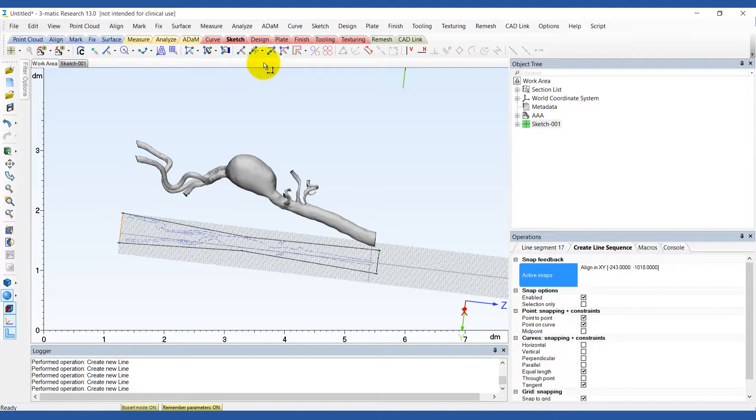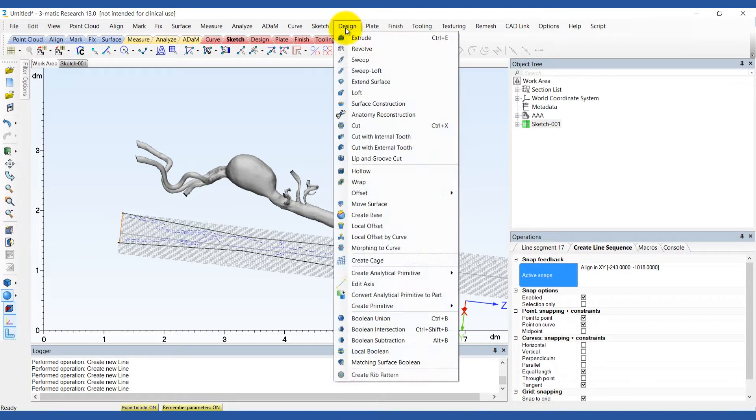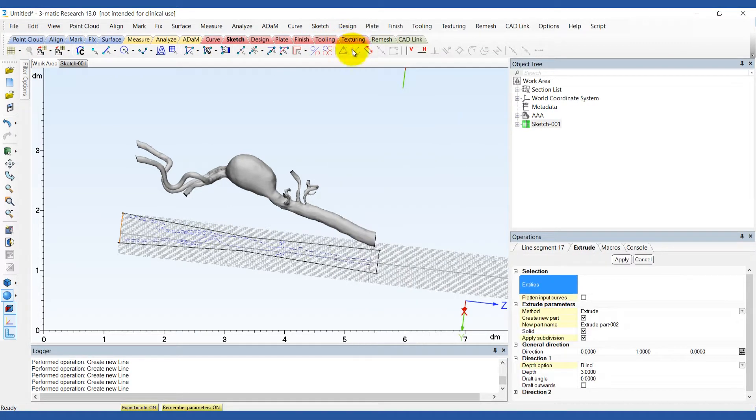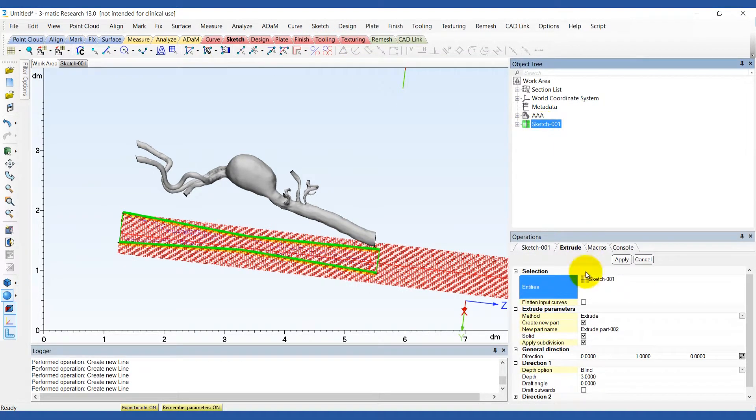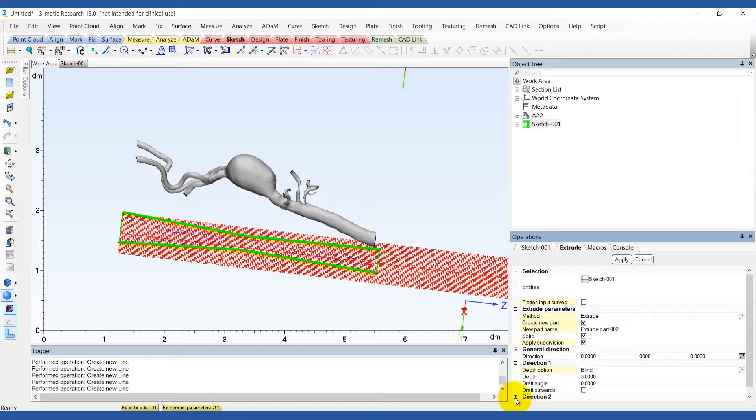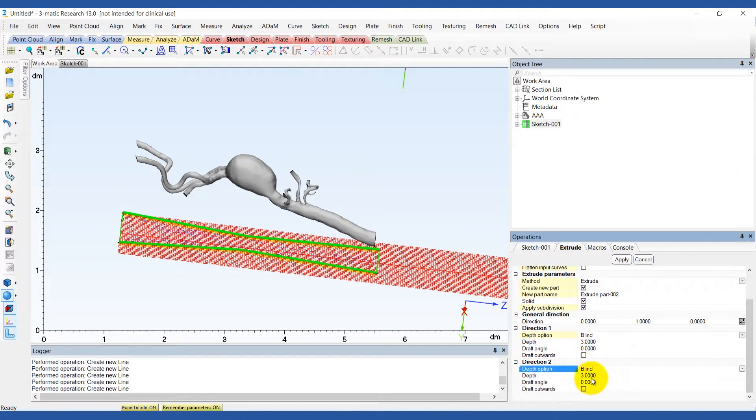To give the sketch a base thickness extrude the sketch 3mm in both directions. This will give us a 6mm thick base.